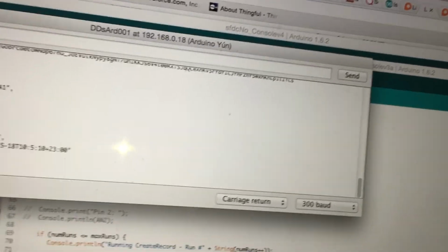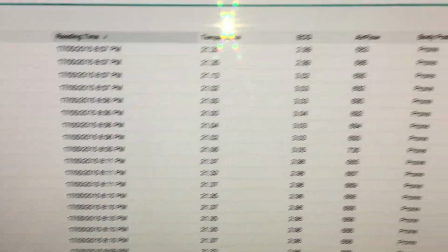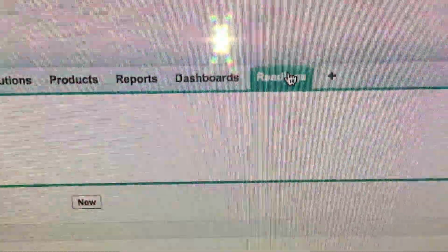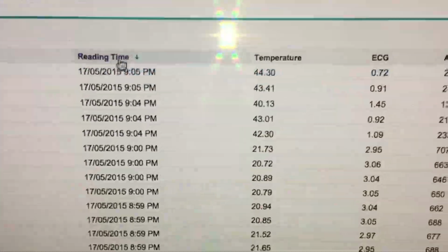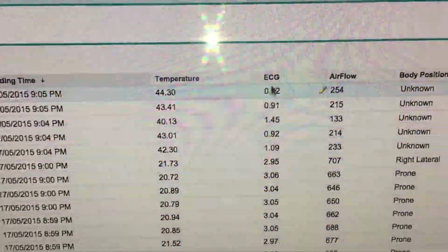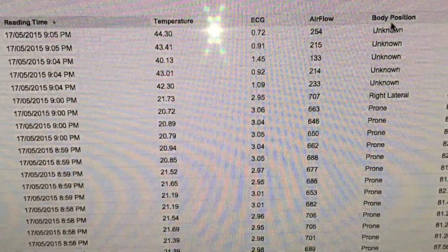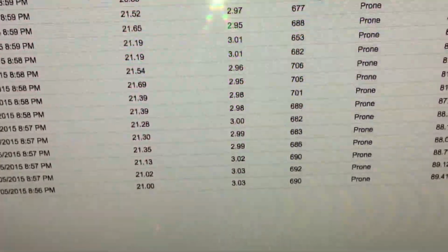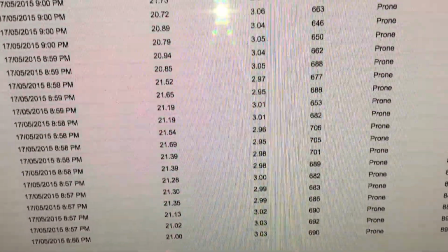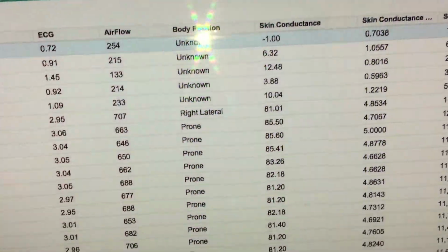And to prove that, let me get on to my other computer. Okay, here we go. So I've created a custom object called Readings. Readings has got fields like, of course, the name of the reading, when the reading was taken, the temperature of the person, the ECG, the airflow, and the body position. At this stage, it's unknown, of course. As you can see, before, when I was playing around, right lateral, prone, which means I was flat on the ground. Skin conductance, voltage, skin resistance, and the date that this record was created.